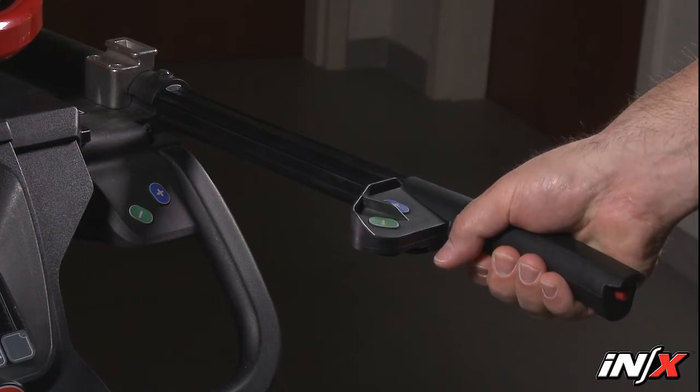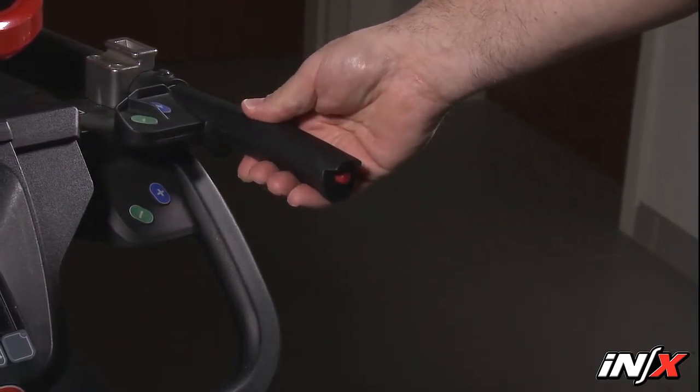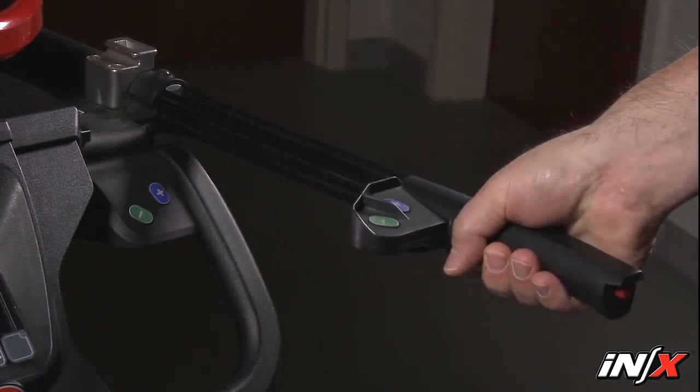To change handle positions, press the red button on the end of the handle and push or pull the handle to its desired position. Release the button and pull or push the handle until it locks. Use the telescoping handles only when they're in the locked position. The attached set of control buttons remain with the handgrip in either position.